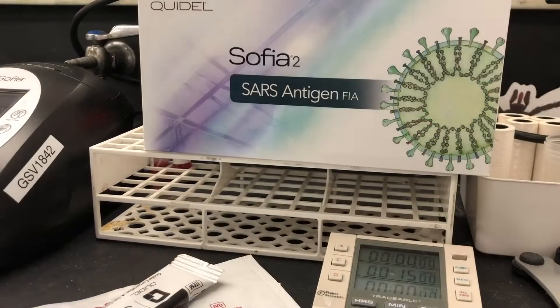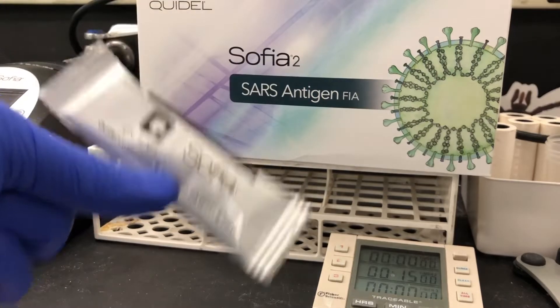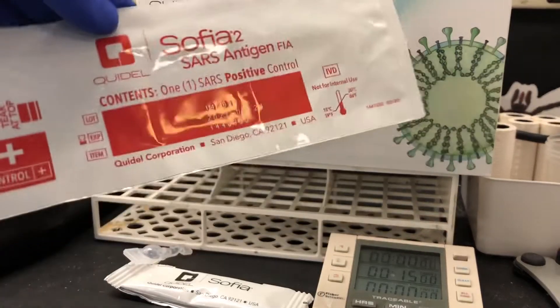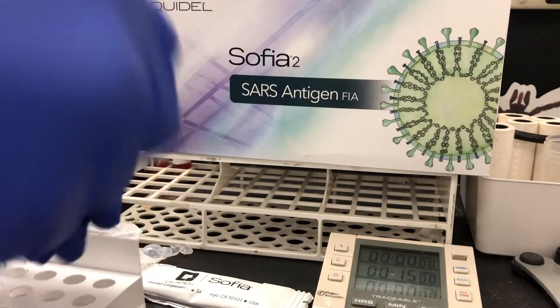For this, you're going to need a few things to run the test. You're going to need a test cassette, some reagent solution — I'm using a positive control as my patient — and you're going to need a reagent tube. You also need a pipette, which I forgot to show here, but I'll get to that in a minute.